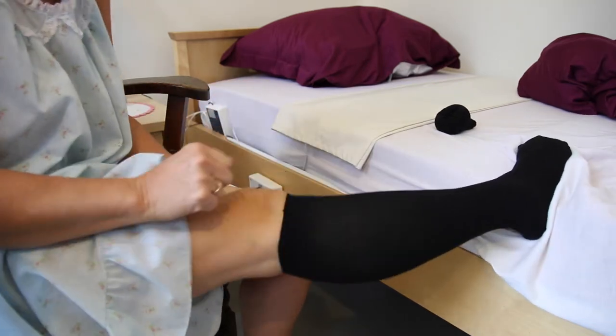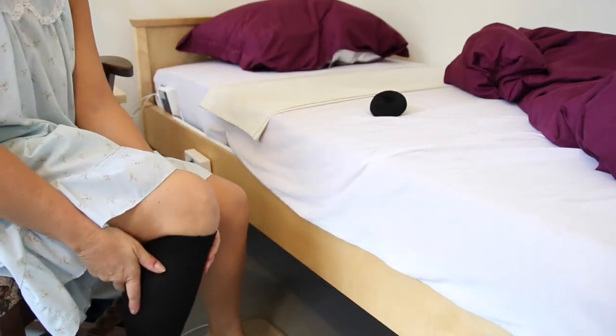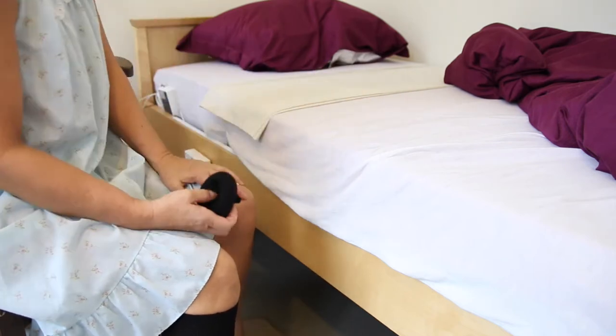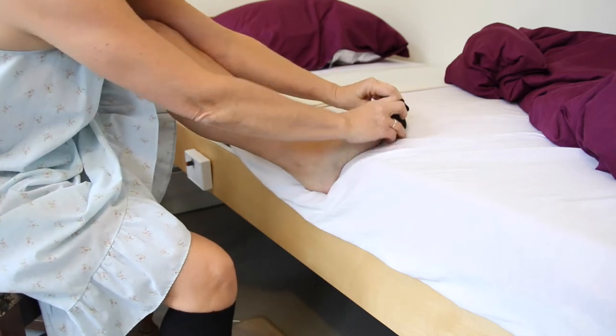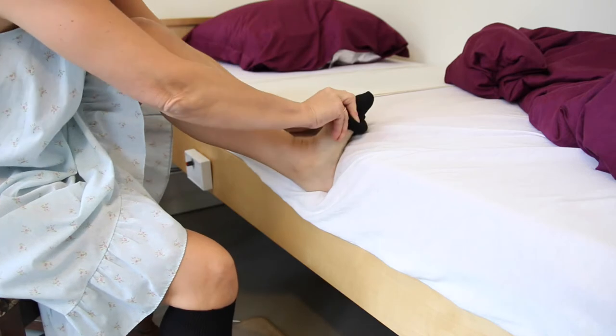Very good, that was quite easy, wasn't it? Now you can do the other foot the same. Put it on your foot, and then roll it up.